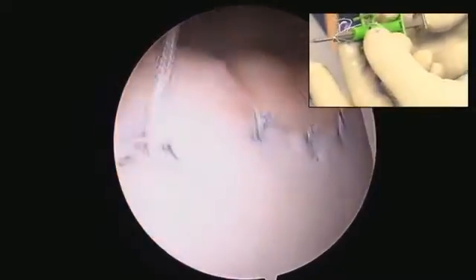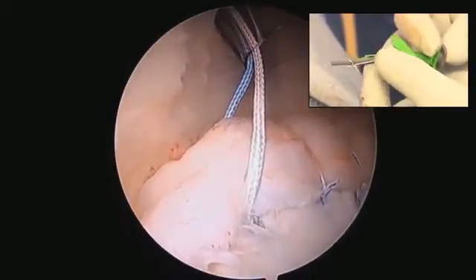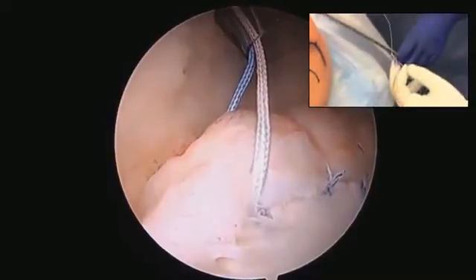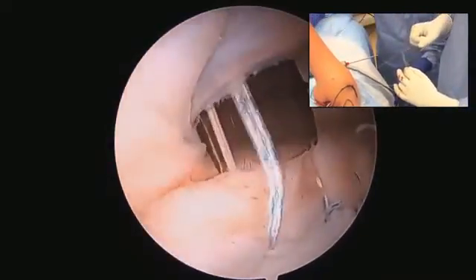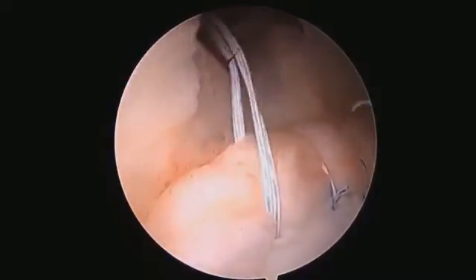Then, on the outside, you're putting that blue strand through the little loop and pulling back on the blue strand, which will advance the little Juggernaut noose there on the back side. Now you're pulling on the blue and it's going to deploy and will go completely around the labrum.